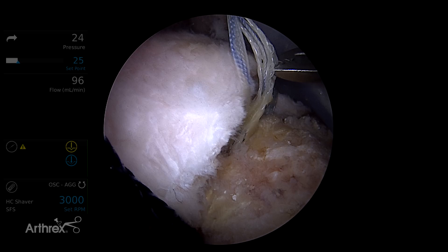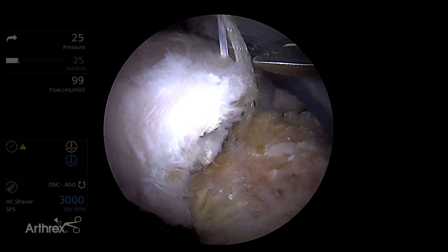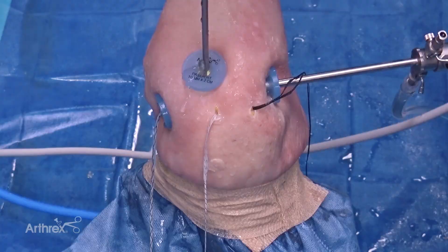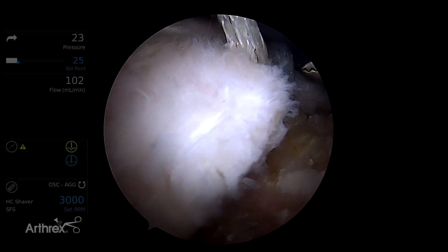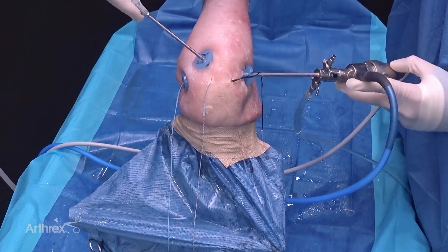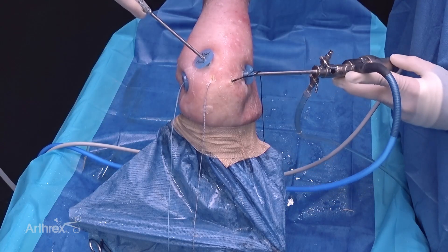In this case we're going to go with an entirely knotless construct. So we remove the suture tapes, leaving us with three sets of fiber tapes — one from each anchor: anterior, middle, and posterior. You can see these are color coordinated to really help distinguish them in the joint.